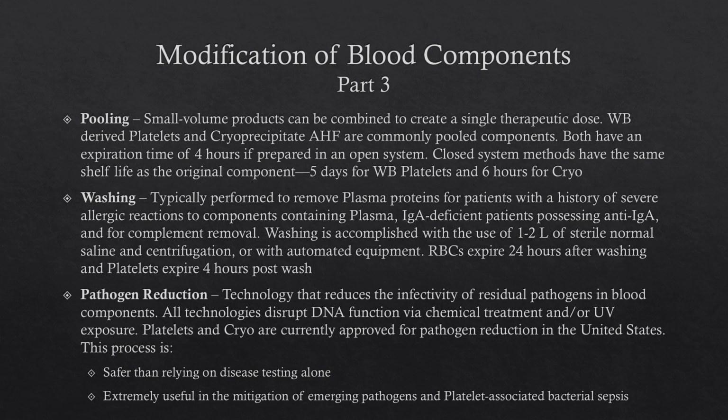RBCs that are washed are going to expire in 24 hours due to the open system, and platelets, because they're room temperature, will expire 4 hours after the wash.